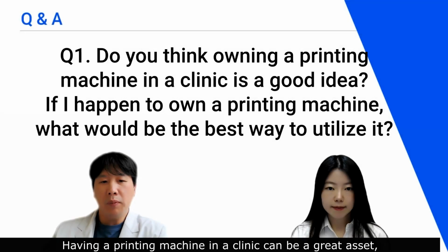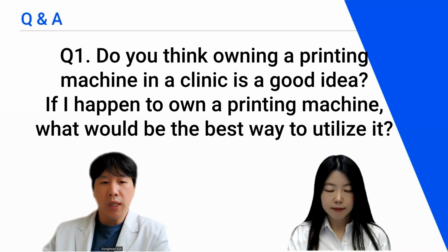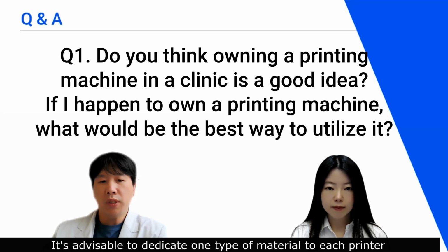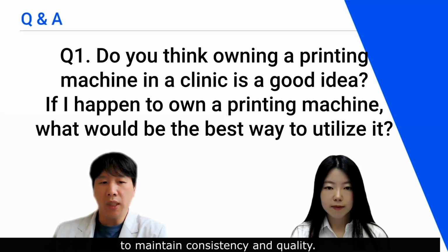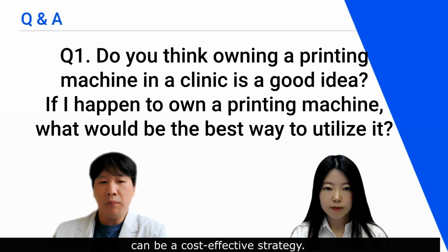Having a printing machine in a clinic can be a great asset, especially if you focus on its optimal use. It's advisable to dedicate one type of material to each printer to maintain consistency and quality. Starting with a budget-friendly printer that is well-suited to your specific needs can be a cost-effective strategy.